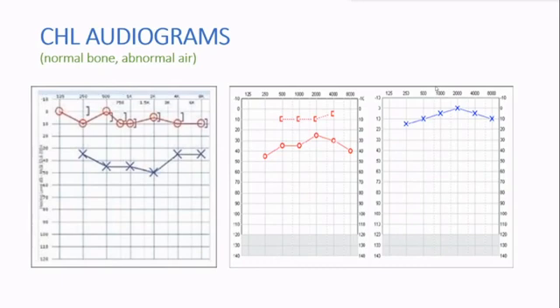The other symbols, which look like an ear, okay, the ear thing is bone conduction. So in conductive hearing loss, the air conduction is reduced. However, the bone conduction will remain normal because the bone conduction correlates to your cochlear reserve or cochlear function.